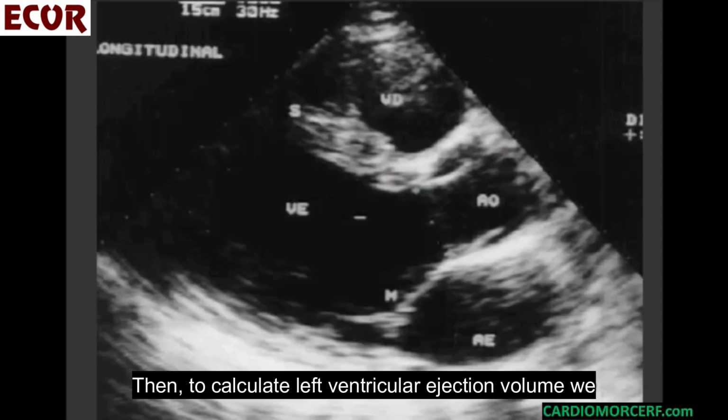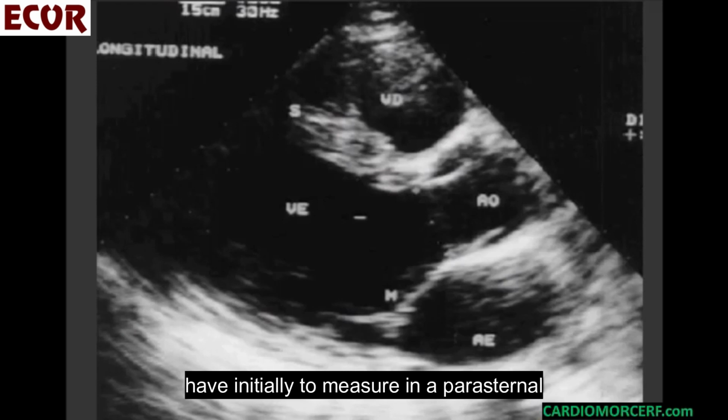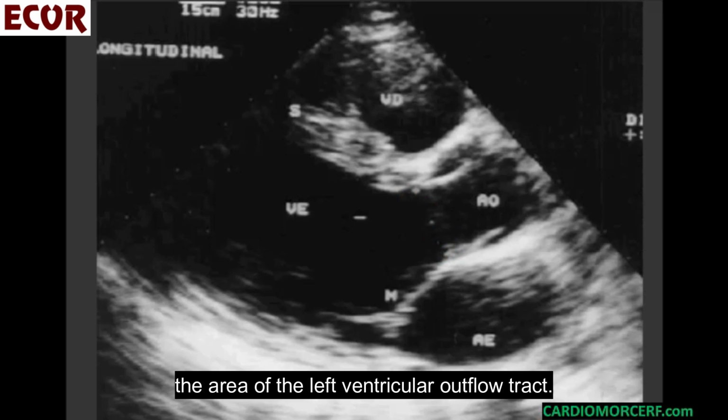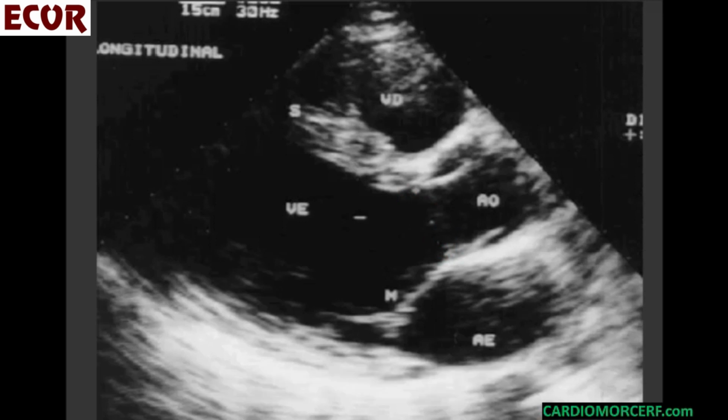Then, to calculate the left ventricular ejection volume, we have initially to measure in a parasternal long axis the distance from the insertion of an aortic cusp to the other. Pi times the squared radius of this range will give us the area of the left ventricular outflow tract.